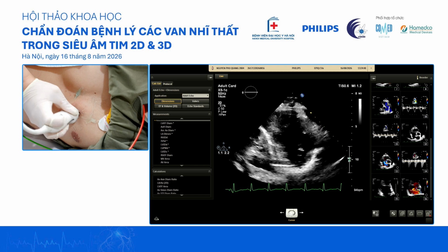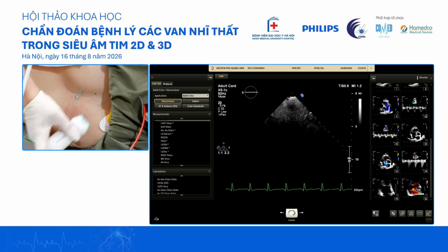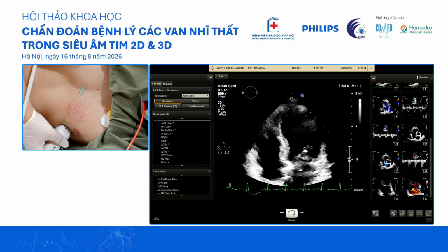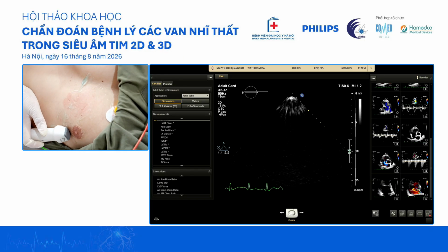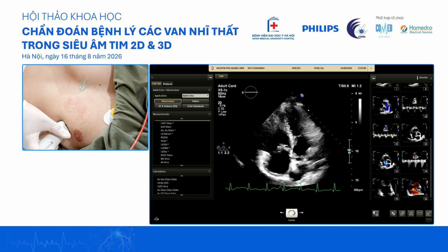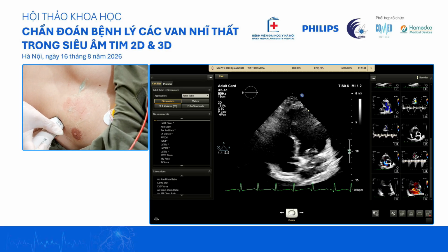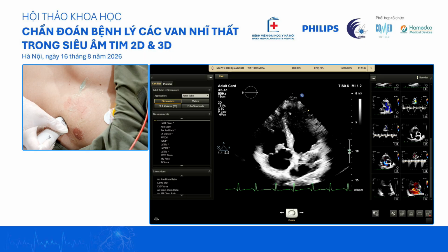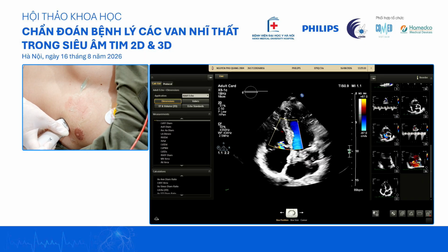We would generally also just take a look at the LV function just for reporting, and then we will go to the apical views. Chúng ta đến với các mặt cắt ở mỏm tim để đánh giá chức năng tim, sơ bộ chức năng tim. So we have the apical four chamber view. Mặt cắt 4 buồng từ mỏm.